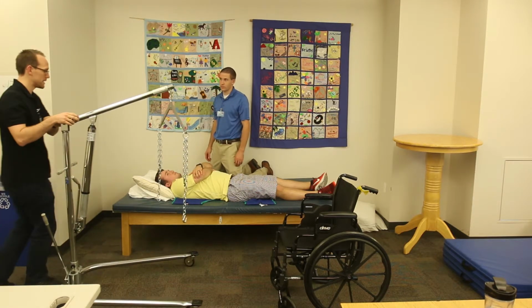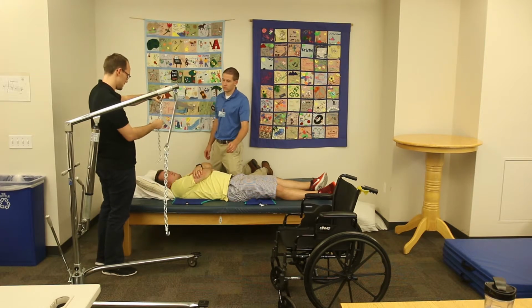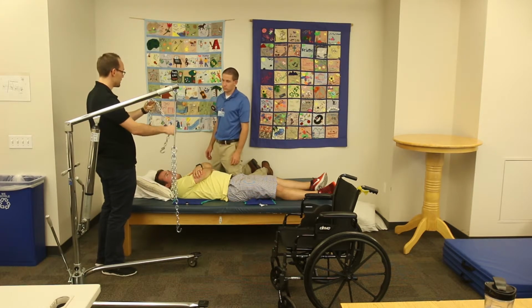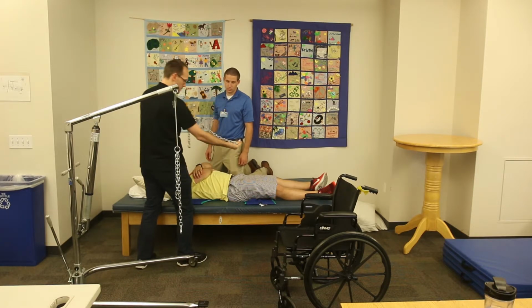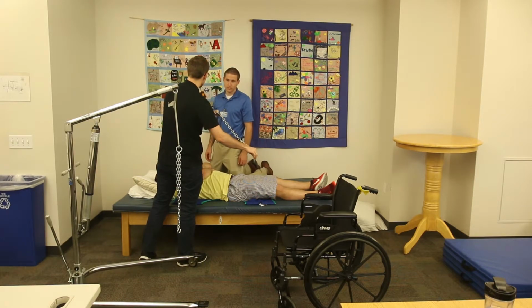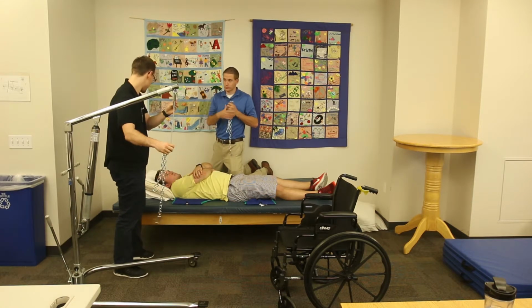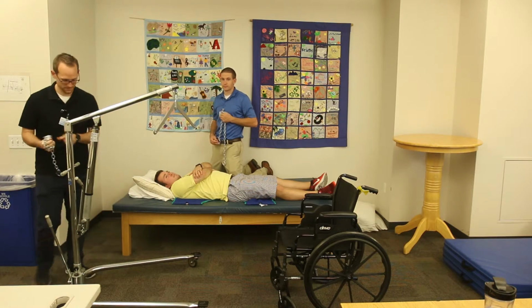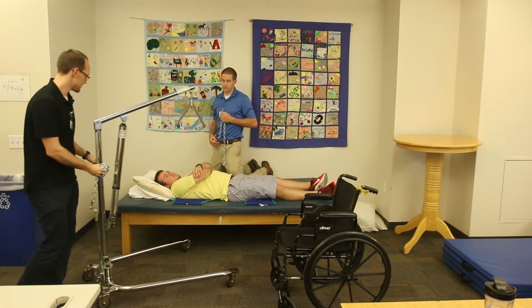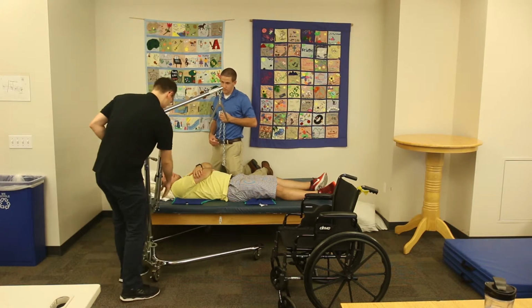All right, Dylan, I'll explain this for you real quick. So I want the short side to be up top and long side to be in the bottom. And I want these hooks to be facing away from the patient so that it doesn't get them. Have you ever seen this Hoyer before? Nope, not this one. Cool. I haven't used it too much, but this is what we got in the clinic.